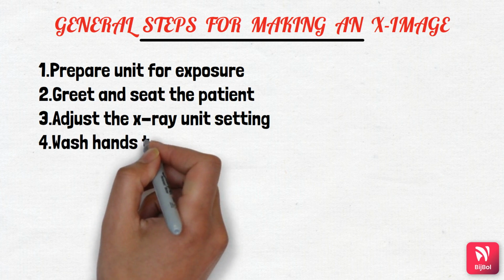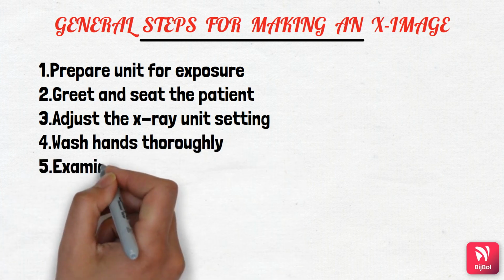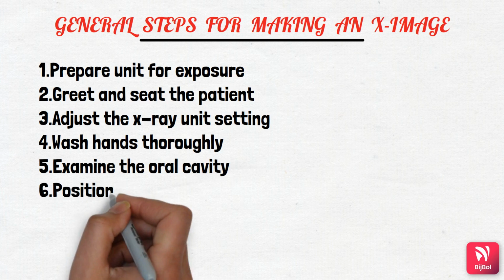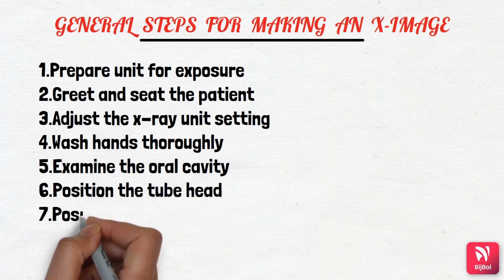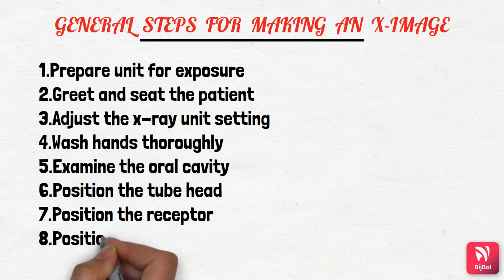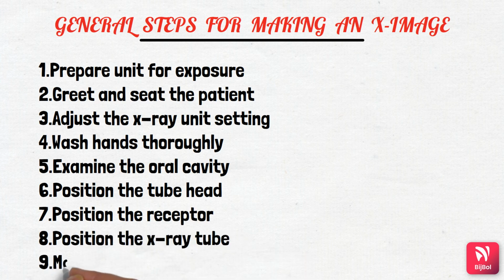Position the dental chair low for maxillary projections and elevated for mandibular projections. Ask the patient to remove eyeglasses or any other metallic instruments or accessories they are wearing. Drape the patient with the lead apron, regardless of whether it is a single exposure or a series of full mouth exposures. If it seems necessary, apologize for any discomfort caused during the procedure, after the examination or the procedure.